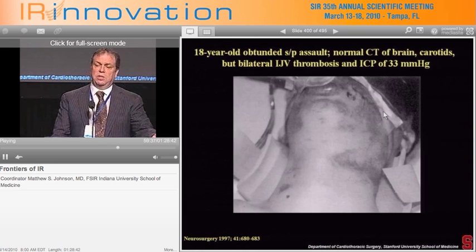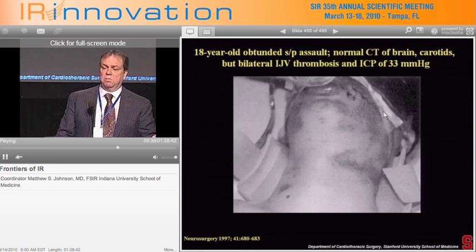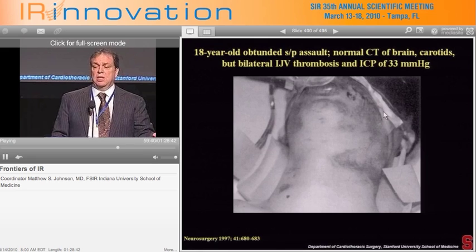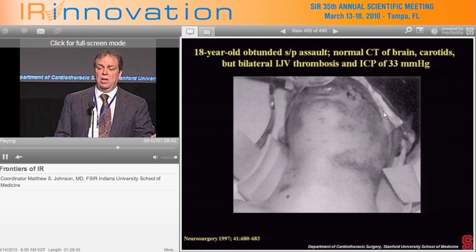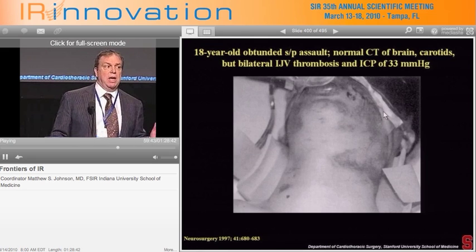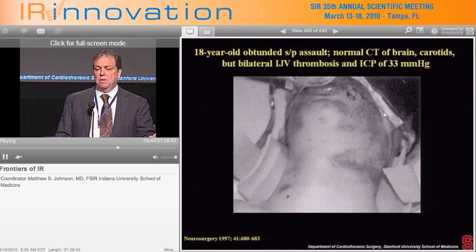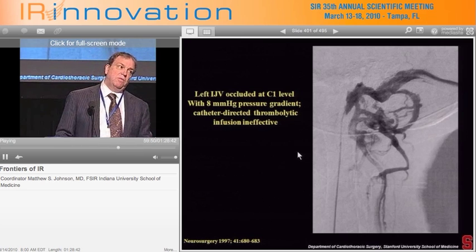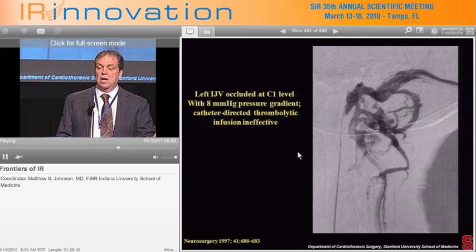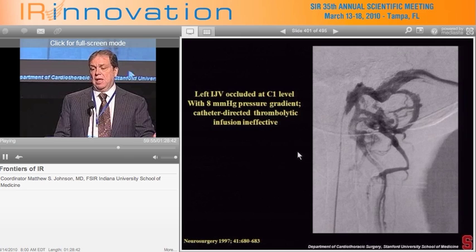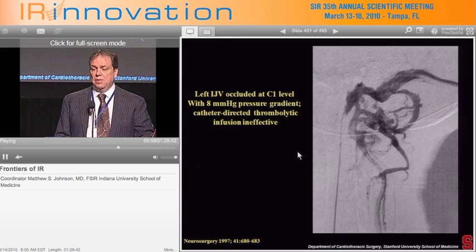An 18-year-old obtunded patient presented status post-assault with a normal CT of the brain and carotids but bilateral internal jugular thrombosis. This typical appearance — often seen in MS patients — shows large vertebral collaterals coming around the occiput and down. This is the result after stenting in this patient.